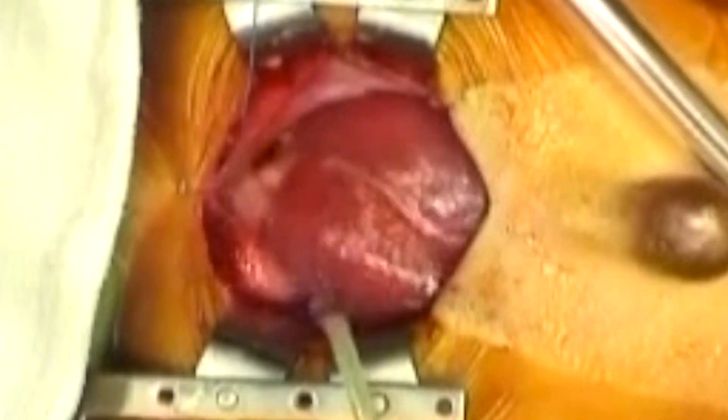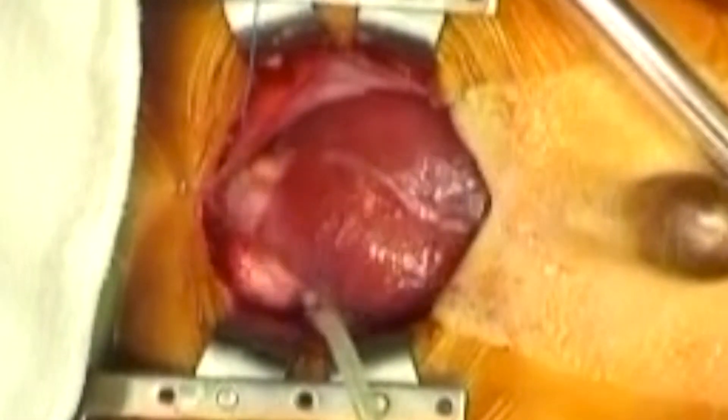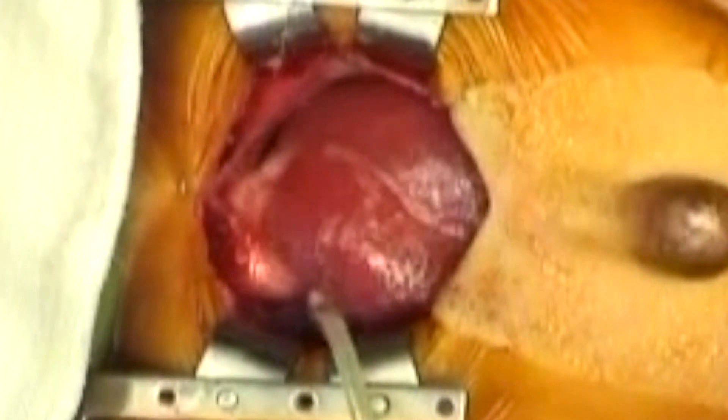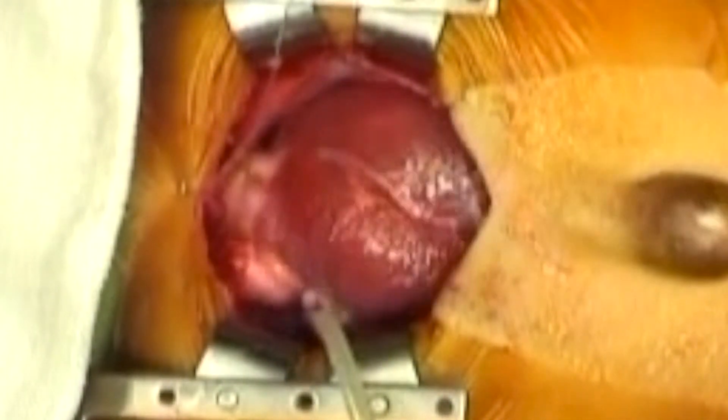Off screen, the cardiopulmonary bypass pump has been running for a few minutes to the air. The pump is stopped, the lines are clamped, and then divided between the clamps.